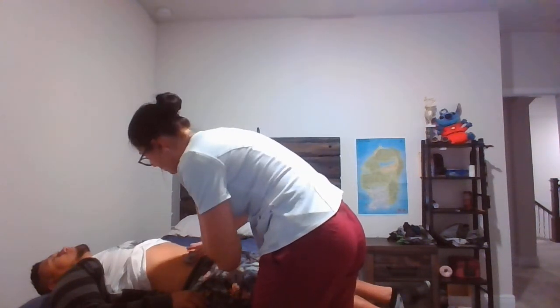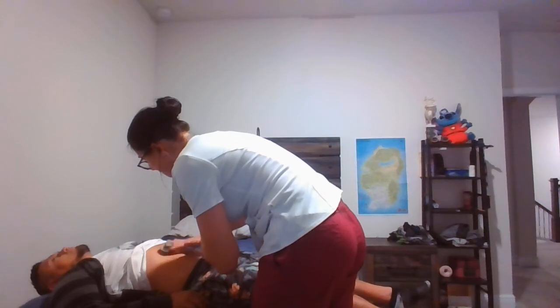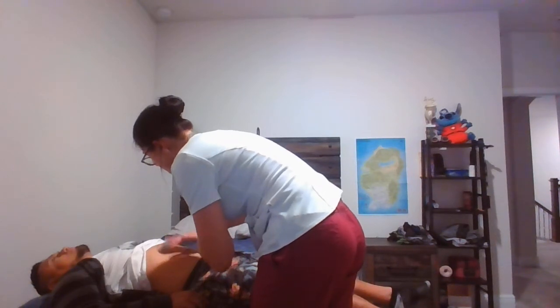Going to auscultate all 4 quadrants. If there are no bowel sounds present, we will auscultate for 5 minutes. Okay, bowel sounds are present, and then I am going to auscultate with the bell for bruits.